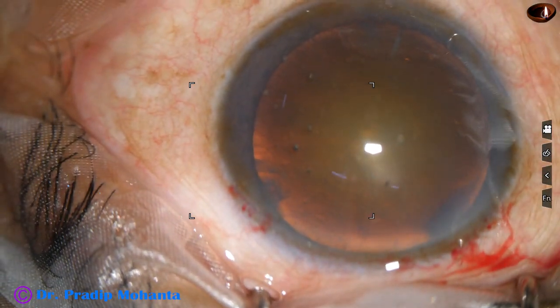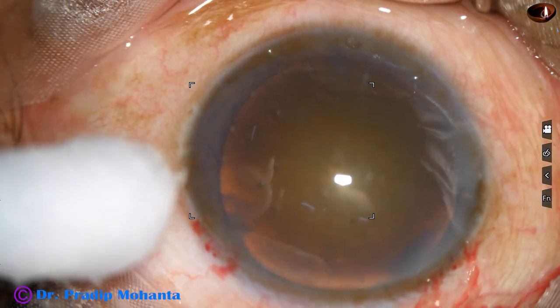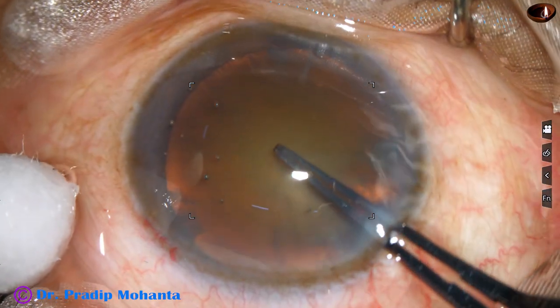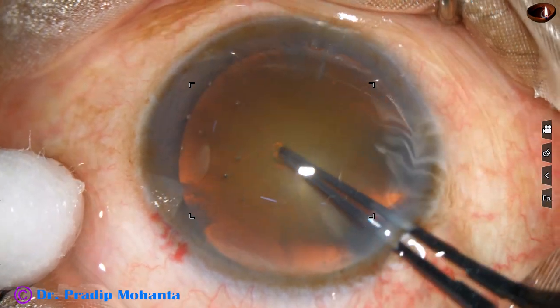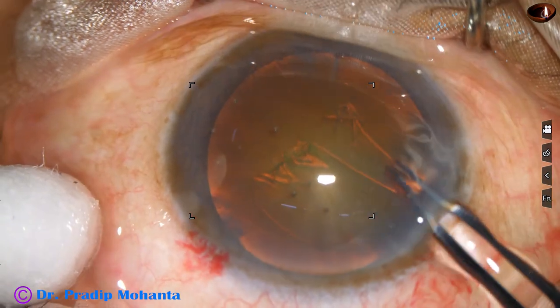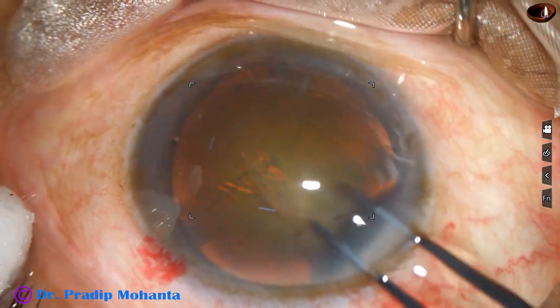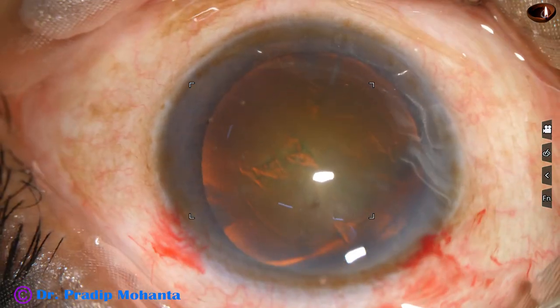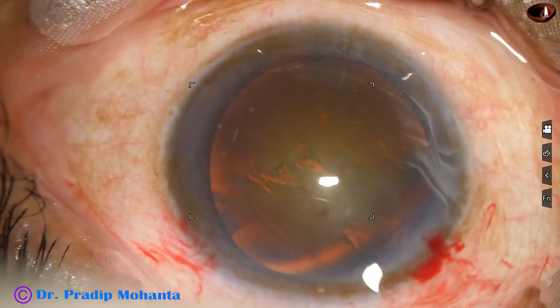We have some amount of red glow in this case, and now capsulorhexis is done with the help of utrata forceps. A capsular tag is raised with the tip of the utrata and it is guided anti-clockwise all around to get an adequate sized rhexis of about 5.5 millimeter.